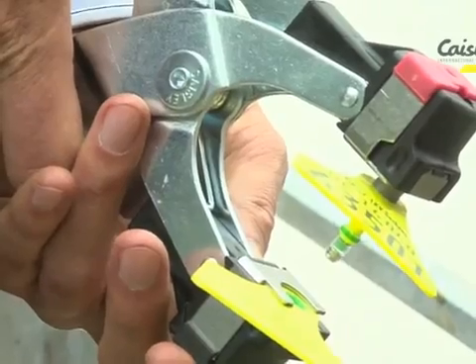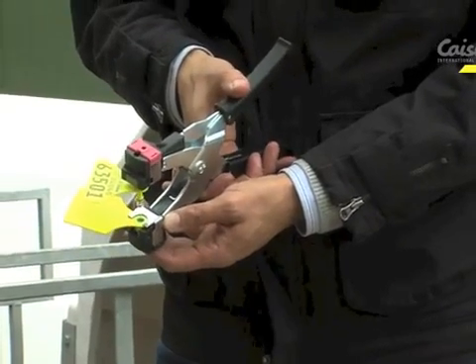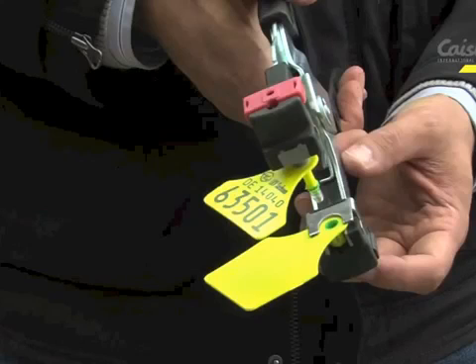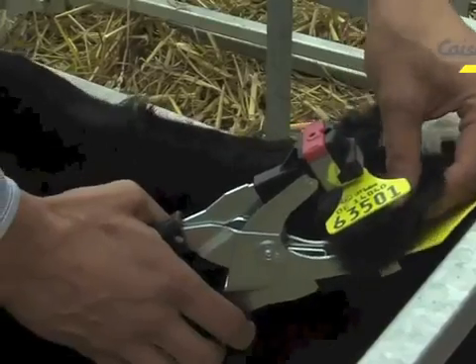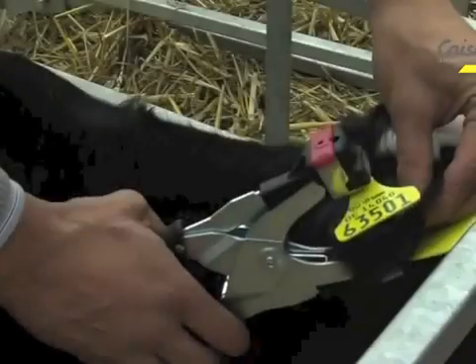Ensure the cutting ring is in place and try to avoid it getting damaged, because this would have an impact on its ability to make the incision and also from a hygiene perspective. The cutting ring should be firmly seated on the tag as it came from the factory. We want to apply the tag between the two ridges of cartilage. The male side, the pin and the sample cutter, is to the outside of the ear. The female with the sample vial to the inside.